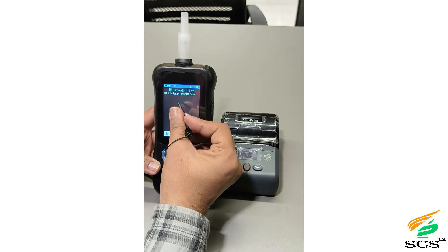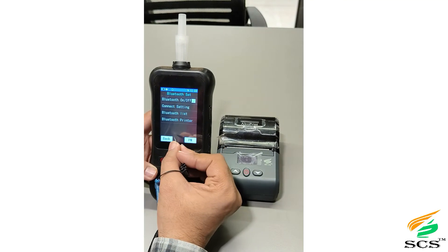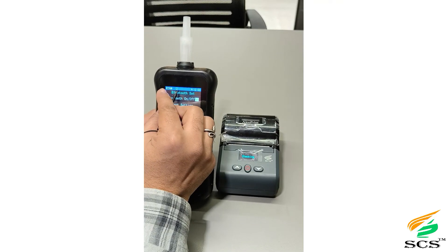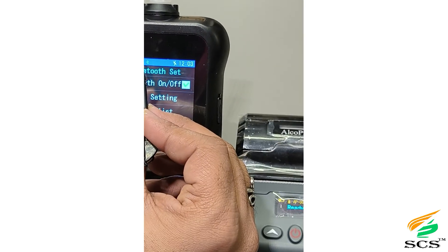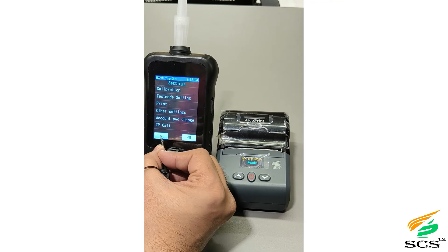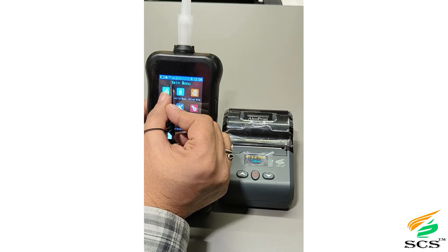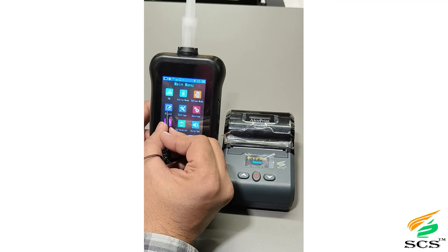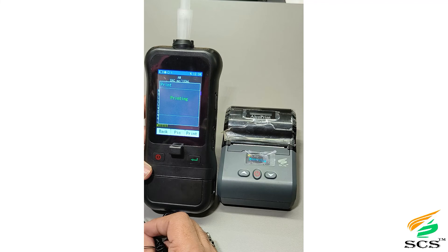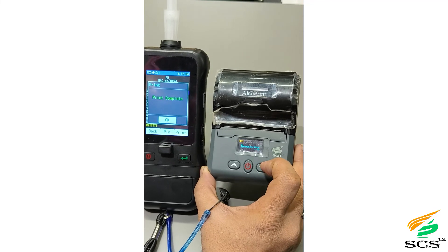The Bluetooth list will show available devices. As we turn on the portable printer, the Bluetooth icon on the device changes from grey to green, indicating the printer is connected. The printer screen will show 'Ready.' The Wi-Fi icon appearing means Wi-Fi is also connected and the device is on the internet. Going to Records and clicking Print, the device screen shows 'Printing' and the printer shows 'Receiving.' As soon as printing is complete, the print comes out from the printer.